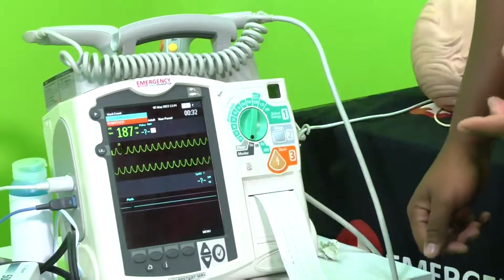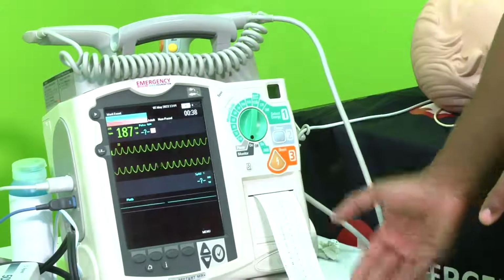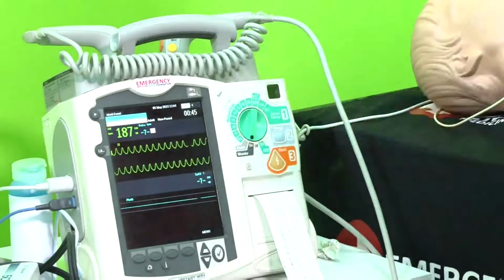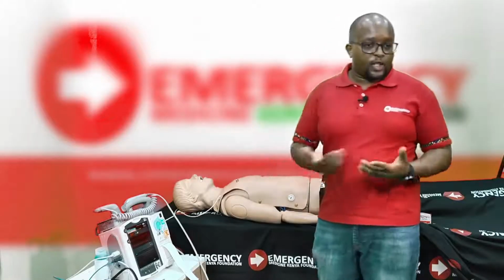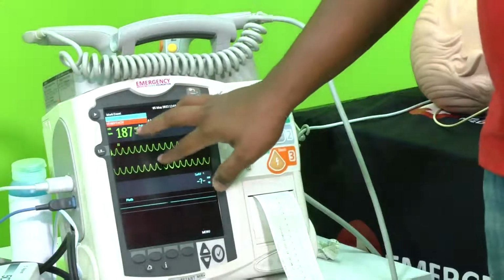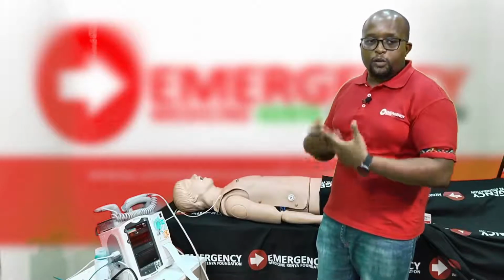I'm going to pause that there. A rhythm strip is faster to get because you may not have enough time to get a full 12 lead ECG. Printing a rhythm strip allows you to see what rhythm is on there, and you're able to analyze the rhythm. So my patient's rhythm is going very fast. They're a bit confused, cold and clammy, BP is a bit low, and I feel that they're in shock. Clinically, they're in shock. Now, the next thing I want to do is terminate this abnormal rhythm you're seeing on the screen by cardioverting the patient to then allow the normal heart rate to go through.